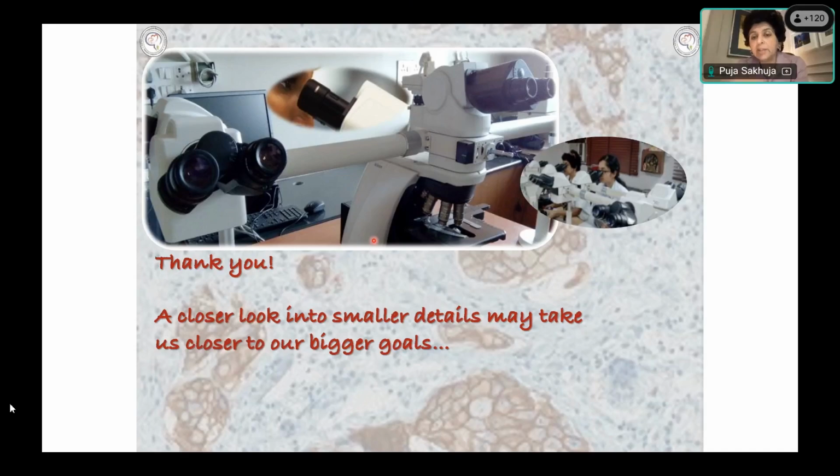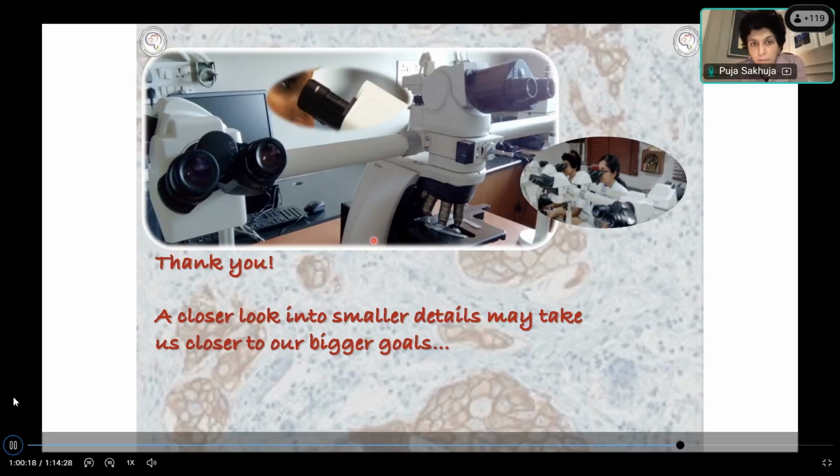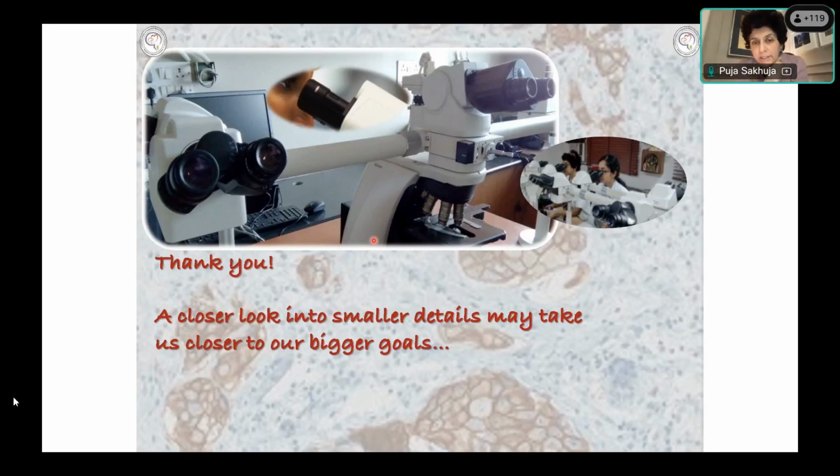Unless they've just said to rule out something, and that's okay then. So the most challenging biopsy is a biopsy where the findings are very small, very minimal, or something that could easily mimic something else, and you have to look very closely and find out what exactly is the etiology in these cases. Okay. Do you have any questions?